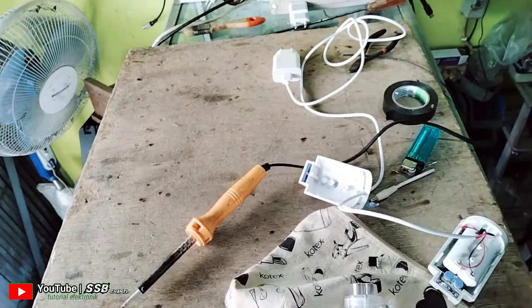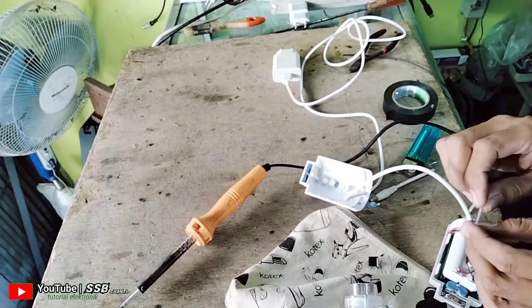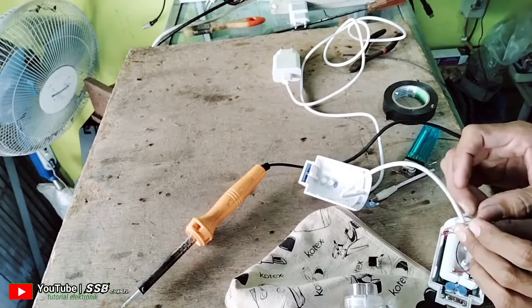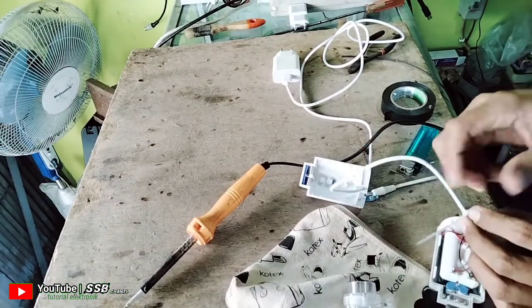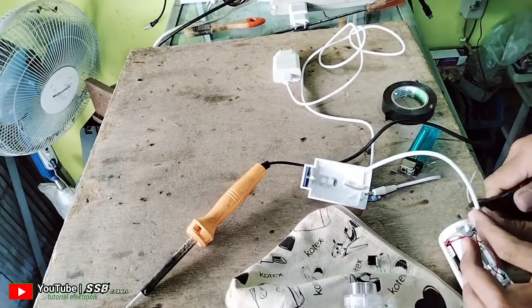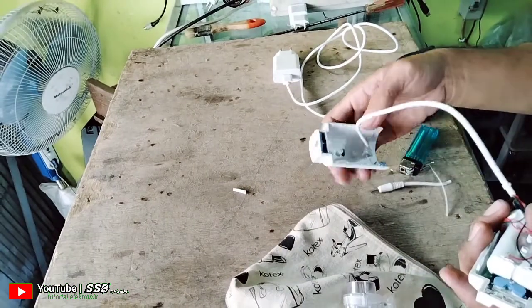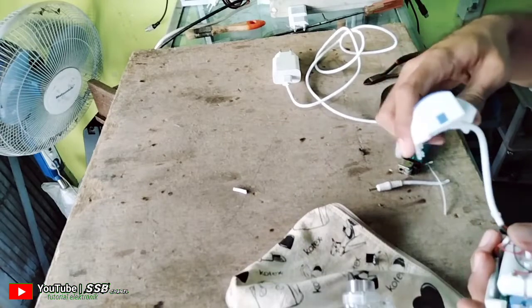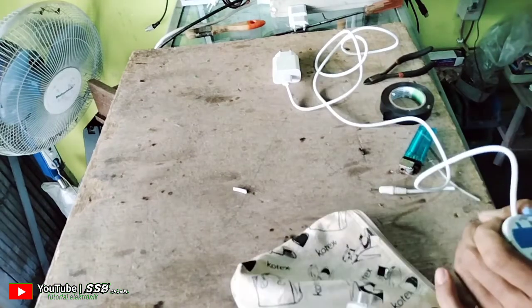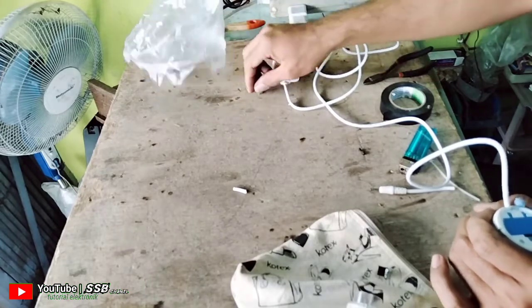Sekarang saya akan menutupnya kembali. Dan kita tali ini ya, tali tis untuk pelindung agar tidak tertarik kabelnya. Kita tutup lagi. Kita bautnya kita pasang lagi.